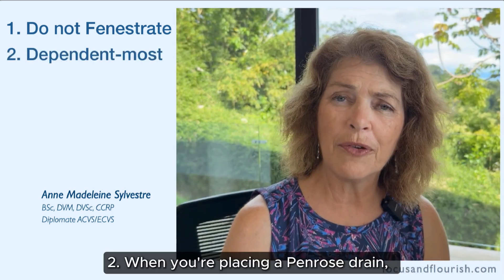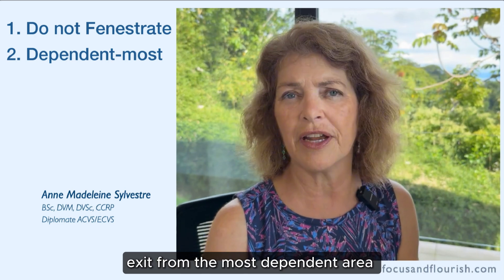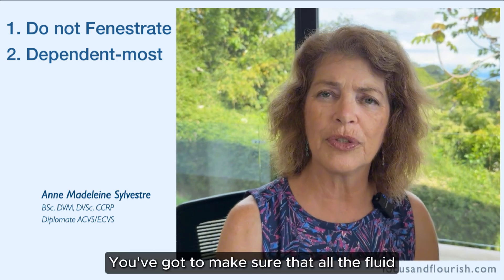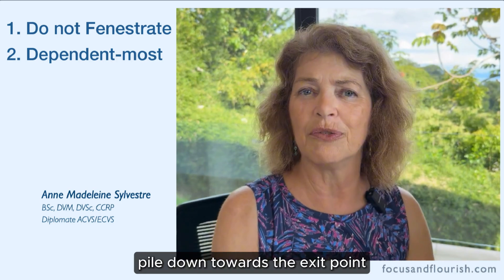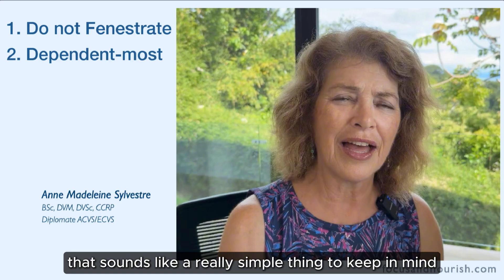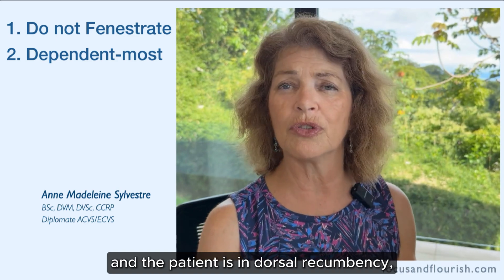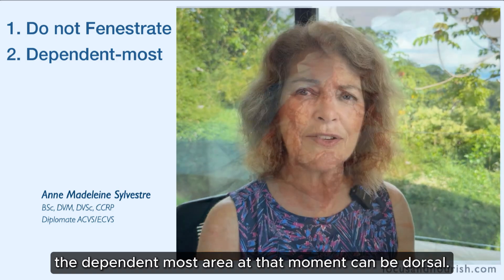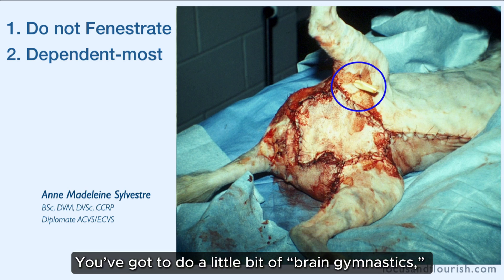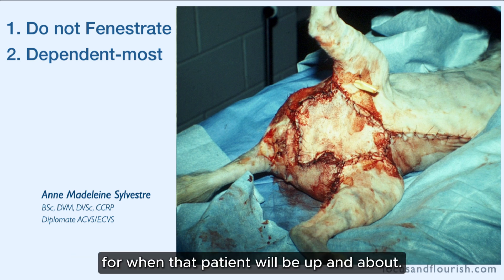Two: when you're placing a Penrose drain, it is very important that the drain exit from the most dependent area of the wound. Because it works by gravity, you've got to make sure that all the fluid in that wound is going to flow down towards the exit point. That sounds simple, but sometimes when you're working on a wound and the patient is in dorsal recumbency, the most dependent area at that moment can be dorsal. So you've got to do a little bit of brain gymnastics — flip your patient around and make sure you find the most dependent area for when that patient will be up and about.